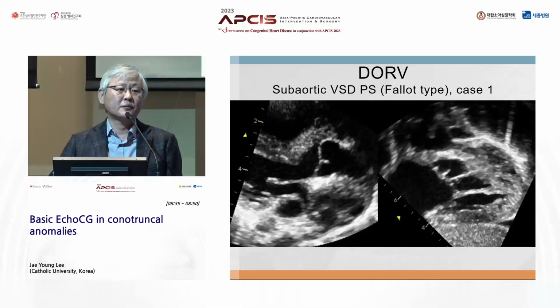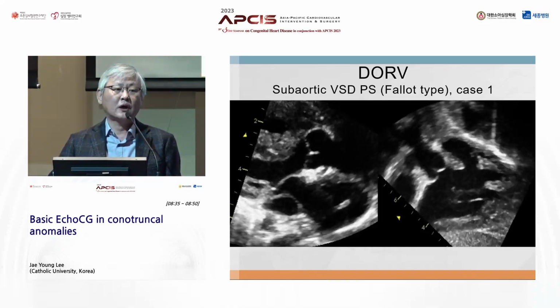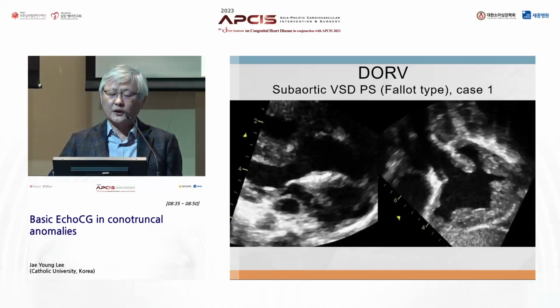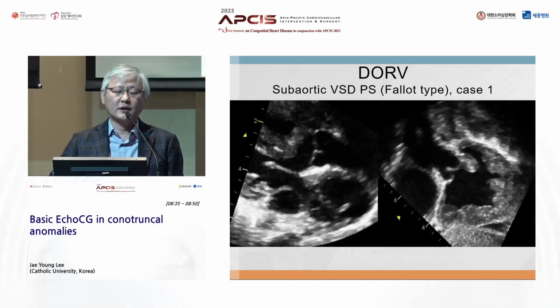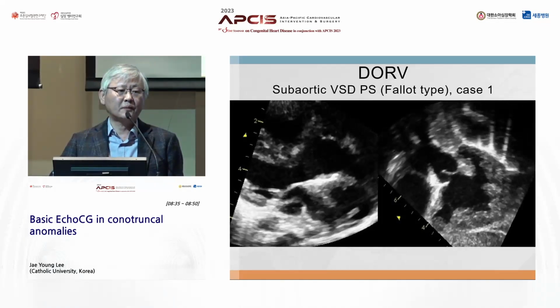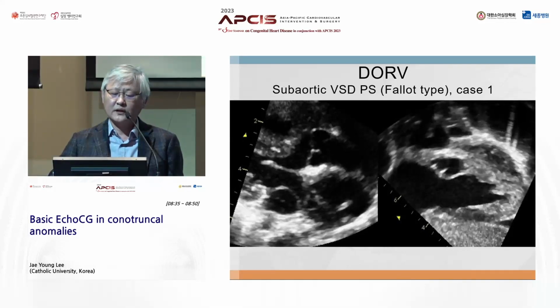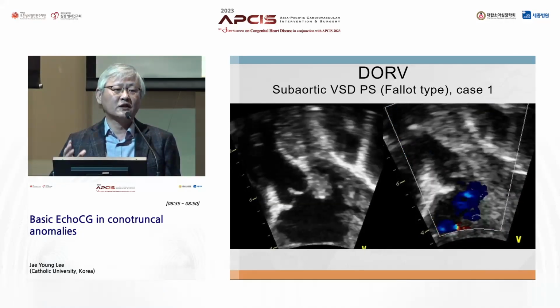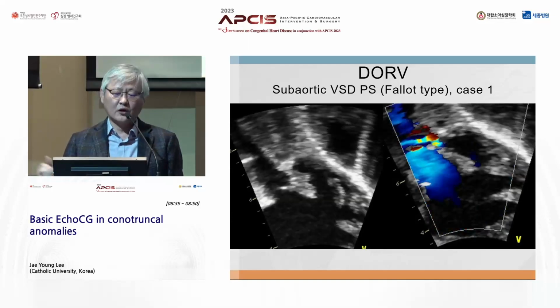There is some distance between the mitral valve and aortic valve leaflets, also double outlet right ventricle. The RAO view shows typical features of tetralogy: a deviated conal septum, hypertrophied septoparietal trabeculations, and a squeezed RV outflow tract here. And zoomed up, the outflow structure is very important in every conotruncal anomaly.